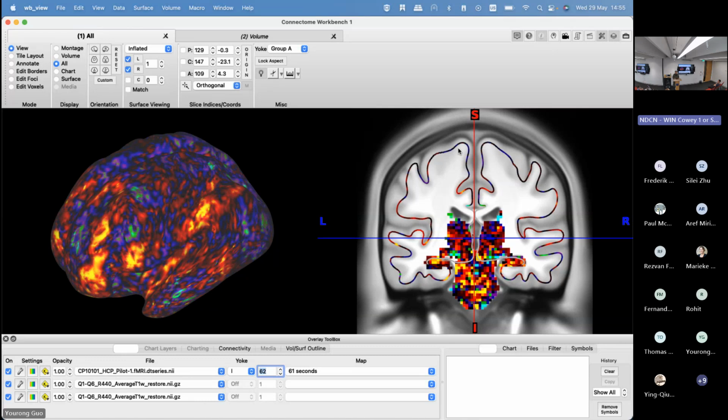Does it always take an average of all the voxels that go into each of the vertices, or how do you call the surface data points? If you look at functional data, you mean the time point? If it's time point, then I don't think they are averaging. So what is the data that I'm seeing at the surface?